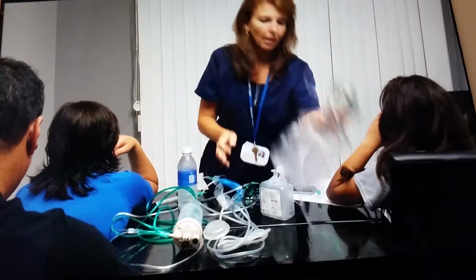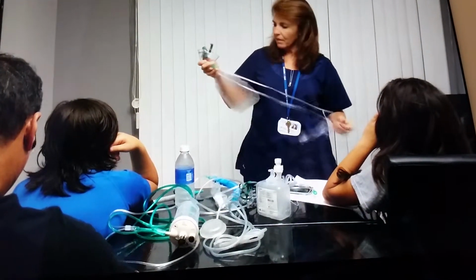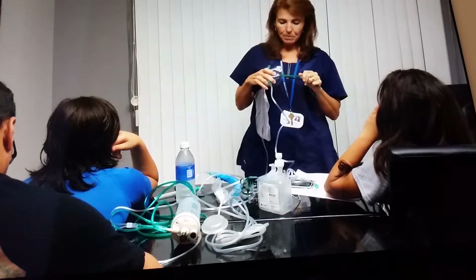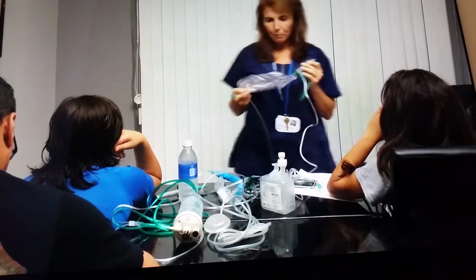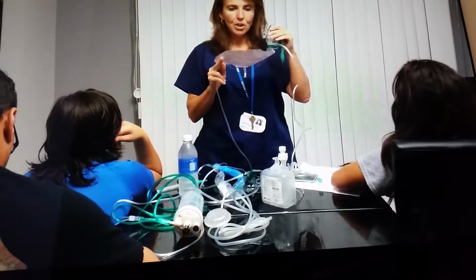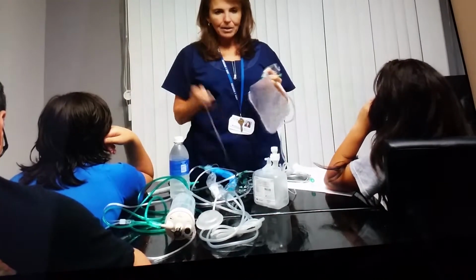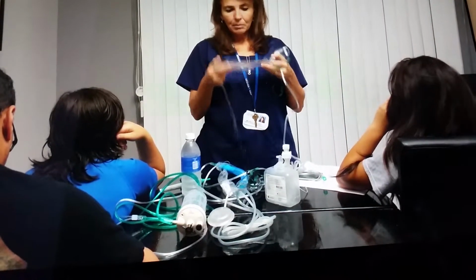Last, short of someone requiring either intubation or non-invasive ventilation, in an emergent situation such as a medical response, the nurse may ask you to get a non-rebreather. As you're retrieving it from the Omnicell, you're going to want to look for the device that has the oxygen-attached bag. With this bag, we want to make sure that we have adequate flow going to the bag. So when it's connected to an oxygen source, the bag fills completely up.